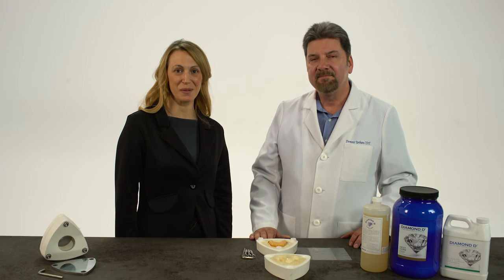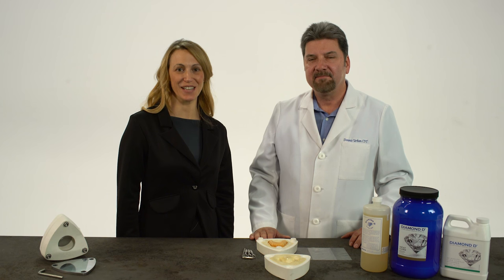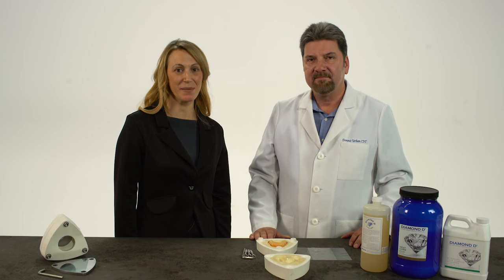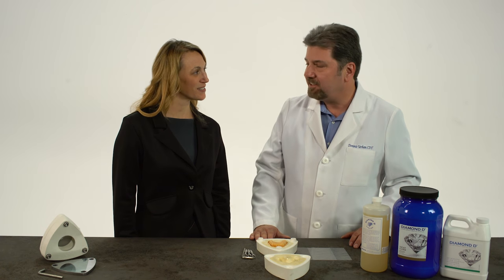Hello, my name is Tiffany, and welcome to Keystone. In this video, Dennis Urban's CDT is going to show you the investing, packing, and curing technique for Diamond D Denture Acrylic utilizing Keystone's Microwave Technoflask. Thank you, Tiffany.